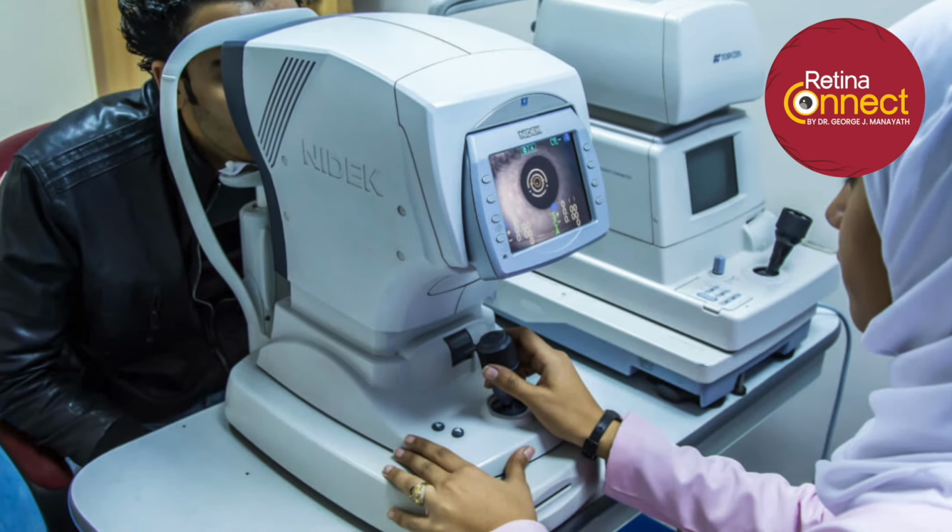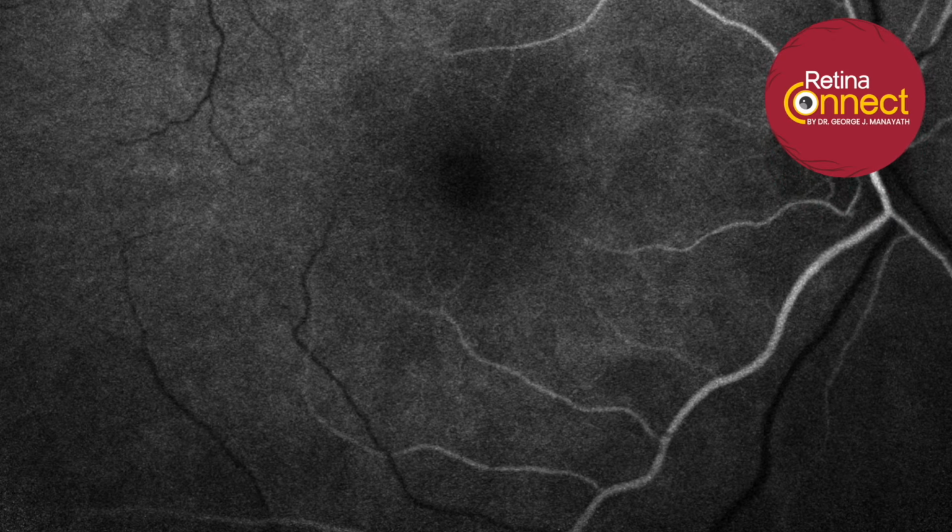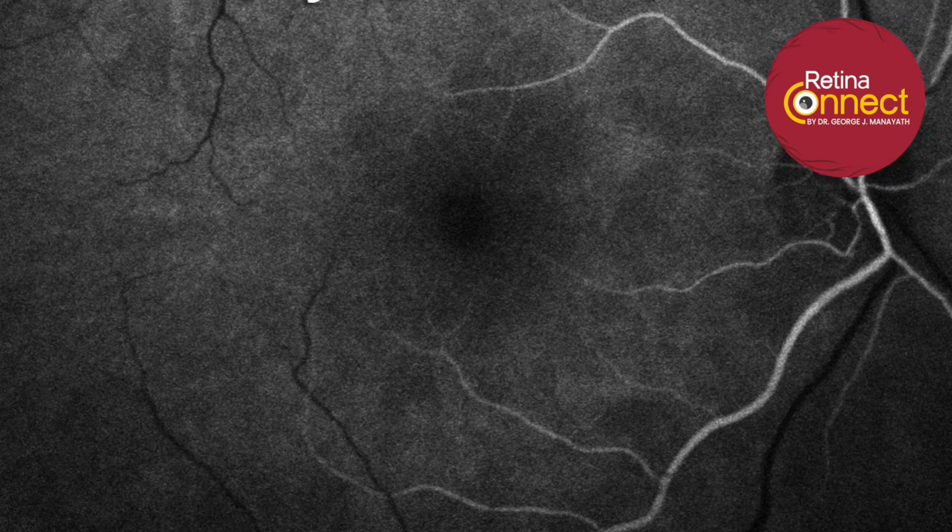There are advanced tests like fluorescein angiography, which needs a dye injection to the arm and then take photos in the eye. But that is an invasive test and is not required for everybody, and it is mostly in the late stages of the disease or in any special situations where the doctor decides that this particular person requires a fluorescein angiography. That is limited only to certain people. So only if it is very much required.